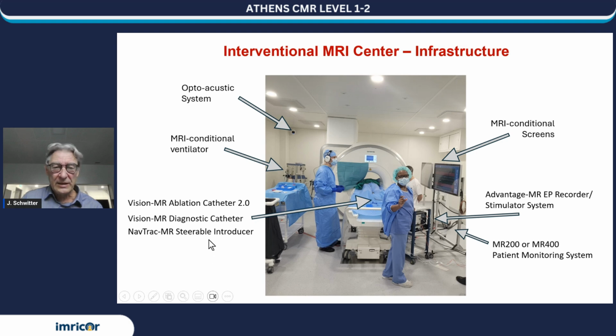What you need here, I start here. Top right, top left, you see the optoacoustic system. So there are such cameras in 1, 2, 3 corners, and they connect visually with this headset, which is worn by Etienne Privot. And then we have the same devices outside, so we can talk to each other. Also, the anesthesiologist is, in this case, outside because it was a very simple anesthesia.